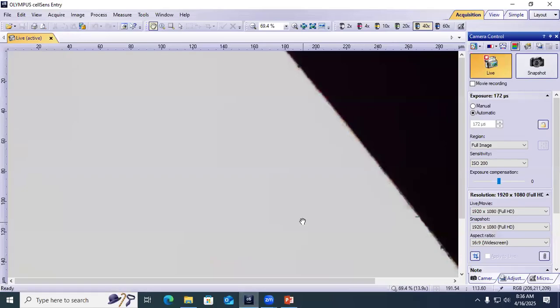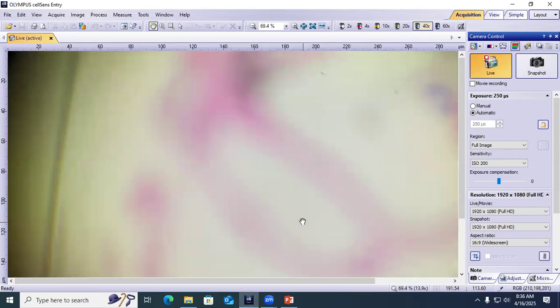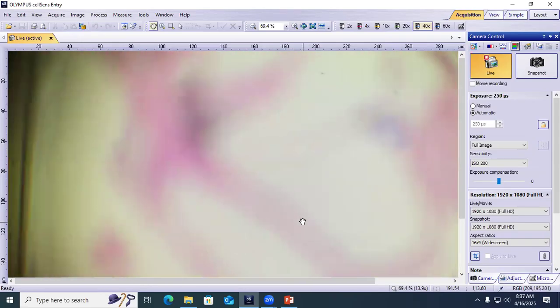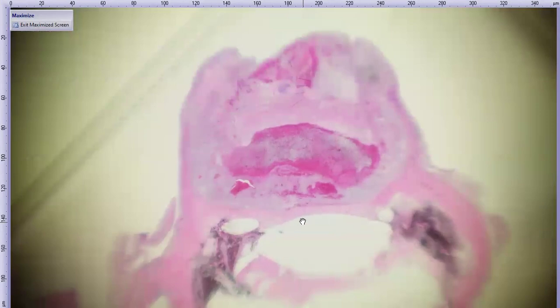All right. Might do this right this time. Oh my gosh. Okay. Wednesday. I'll get all the steps right. Oh my gosh, this one's a really awkward angle on the slide, so I'll do my best.